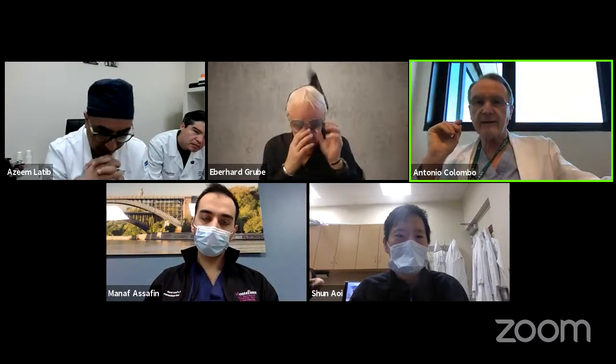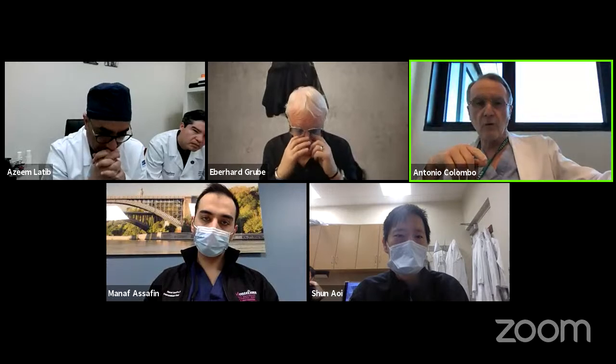I want to be absolutely sure that the vessel size is like that, and I undersize a little bit the high pressure balloon, always. And always think in my mind what kind of cover stent I will use, how to go, because it can happen.